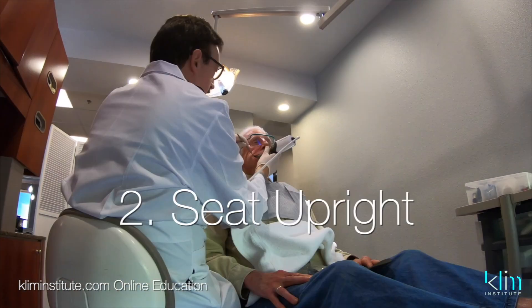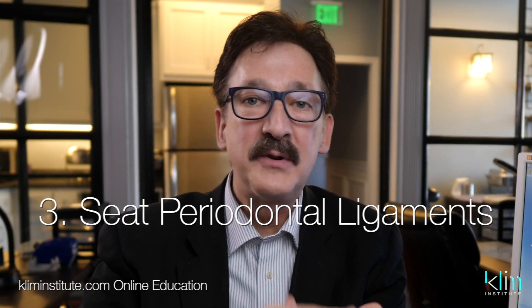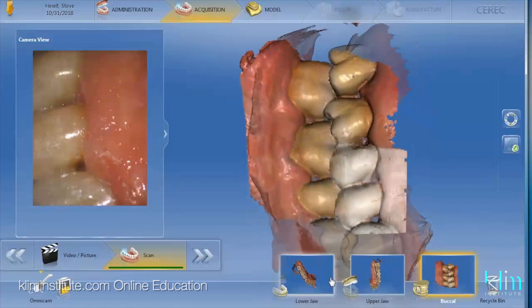Seat the patient up when you take that buccal scan. Before you take the buccal scan, you want to seat the periodontal ligaments — you want to make sure they're all seated. Periodontal ligaments can move around, so the way I do that is have them bite down together a dozen times. Once the PDLs are seated, having the patient in an upright position is more advantageous. When they're on their back, sometimes if they have a hypermobile joint, that jaw can drift back. When you take the buccal scan, have the patient bite firmly — I just have them bite firmly and hold that while you take the buccal scan from CEJ to CEJ.